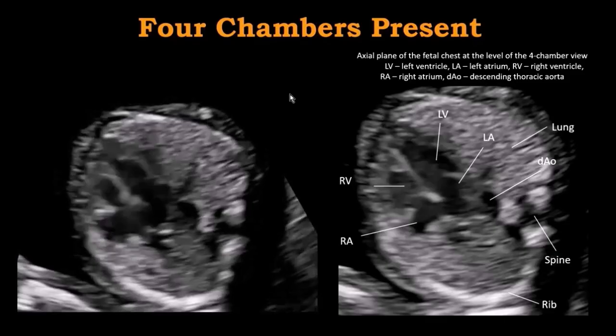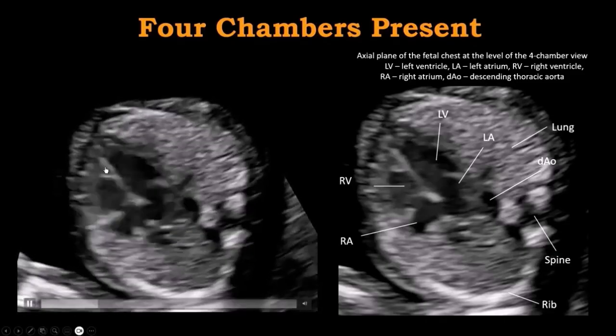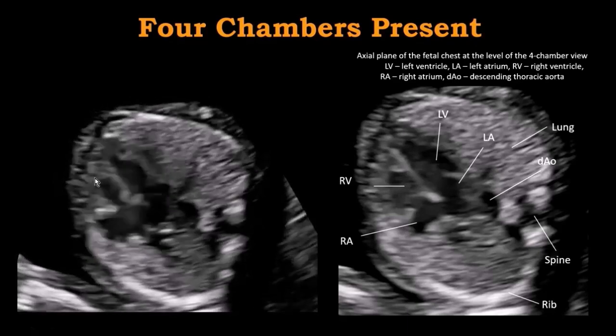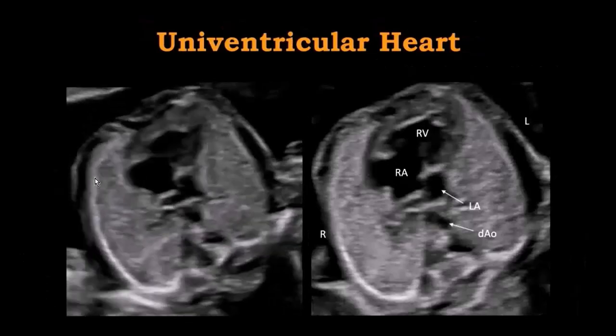So that's why we will recognize in this chart the left ventricle, the right ventricle, the moderator band or trabeculation at the apex from the right side, which is typical, and all the other markers that we usually look at in the level of the four-chamber view.